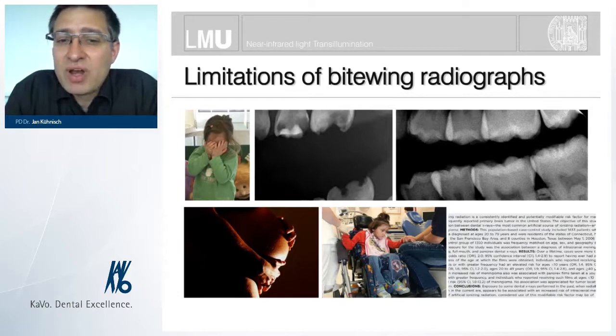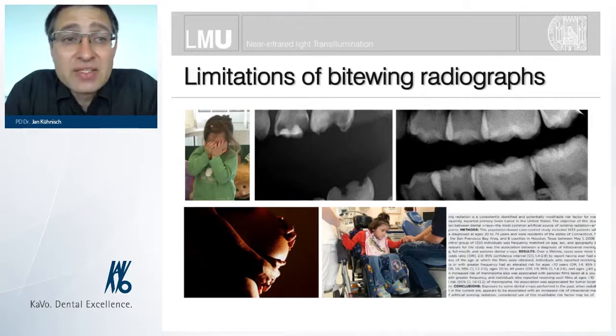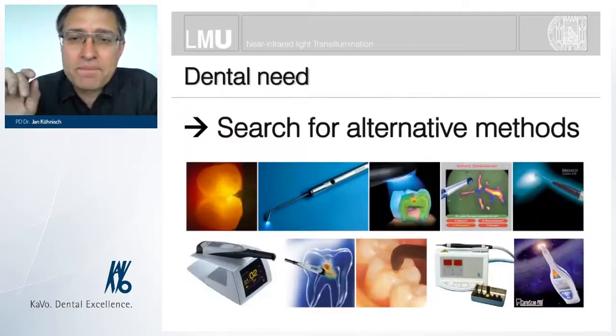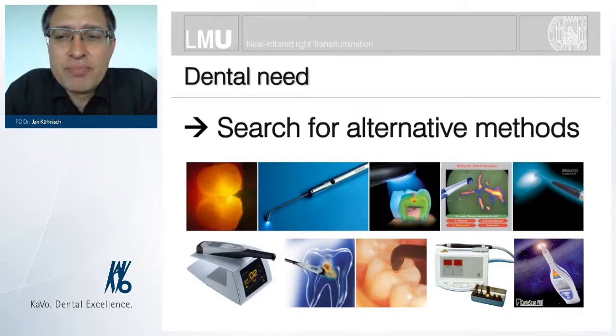Furthermore, we are seeing overlappings. Please think of pregnant women where we have the problem not to perform any X-rays. And it should also be mentioned the group of disabled patients or those with special needs where we have problems to perform bite wing radiographs. And again, there's definitely a need for alternative methods.